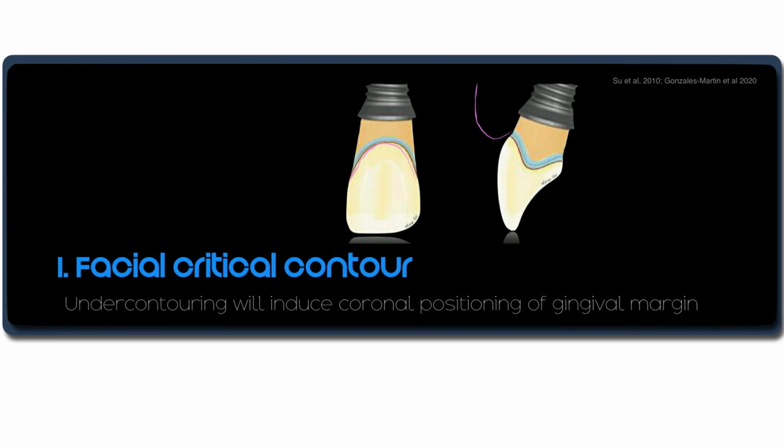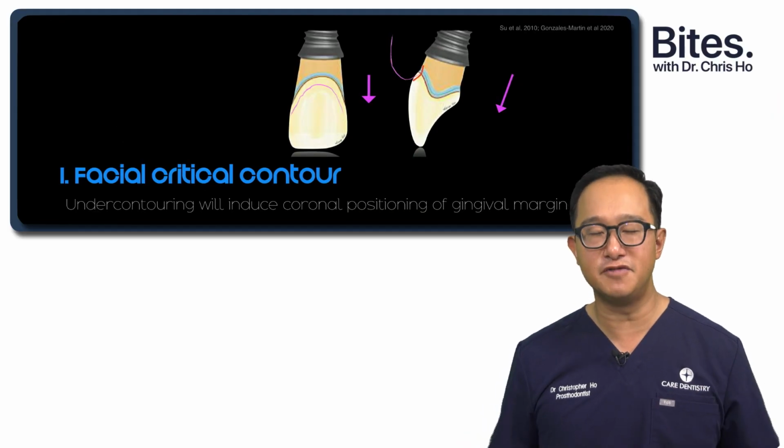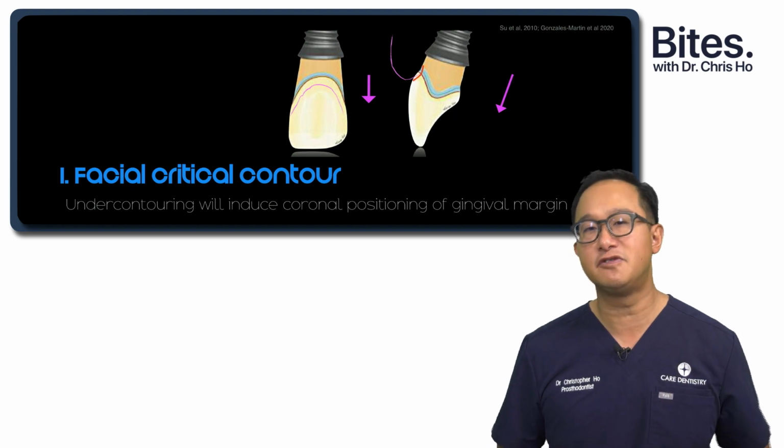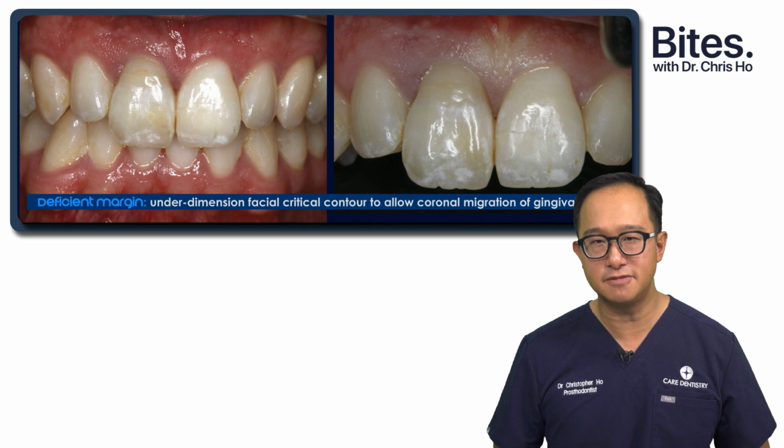So if you over contour, you'd cause some recession. Conversely, if you slightly under contour your restoration, you may even be able to get some coronal creep of the soft tissue and have some coronal positioning of that gingival margin. So it's a very useful technique in those cases where you need a little bit more of that gingival margin.